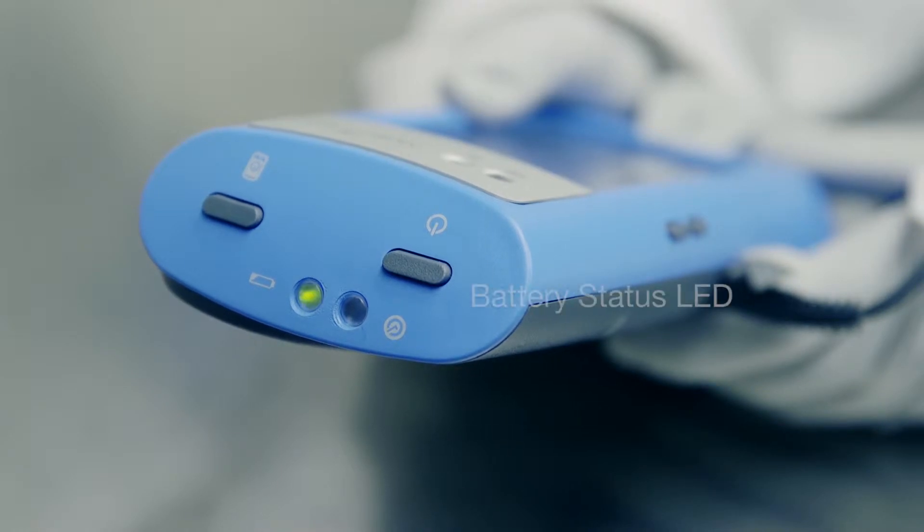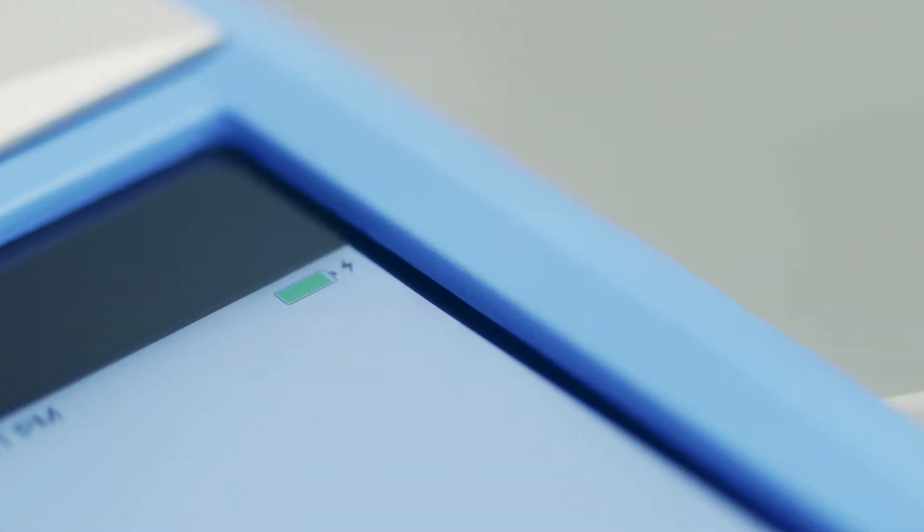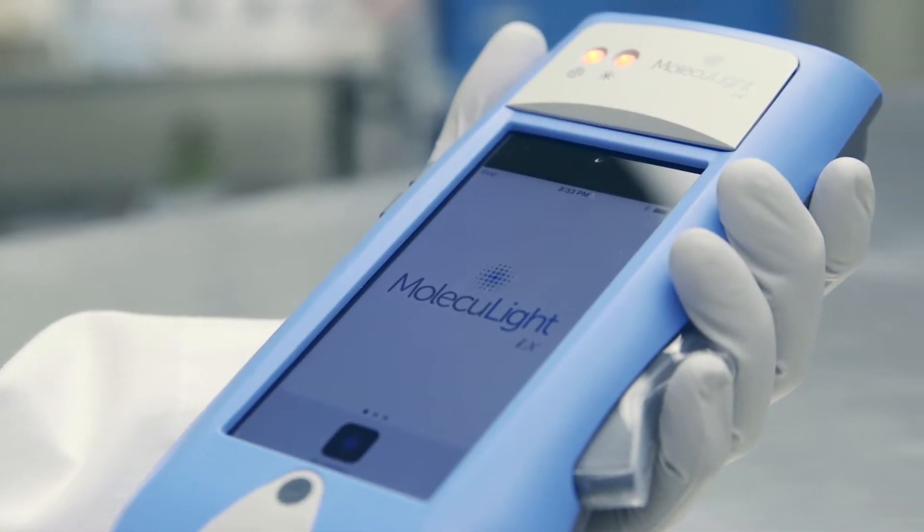You'll be able to confirm that the device battery is charging when you see the battery's status LED flashing. It'll show red for low, amber for medium, and green for fully charged. The iX display screen charging status is found in the top right corner of the screen. It takes approximately five hours to fully charge and should be done at the end of the day.